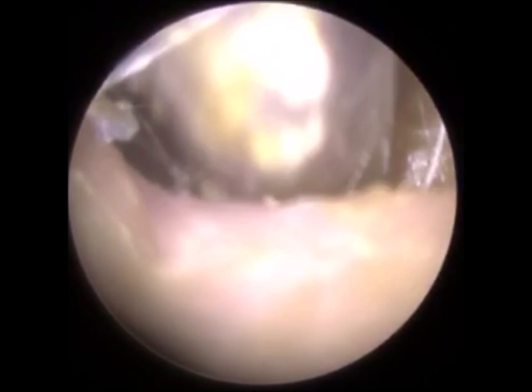One of the issues with dead keratin that's soft like this, whichever instrument you use, whether it's an ear hook, a Jobson Horne, or forceps, is that you kind of slice through it. You're not getting big chunks out. You can see that piece of dead keratin was very damp and soft. And as I mentioned before, when you remove keratin, you do get some bleeding. So that was some of the keratin that we removed.